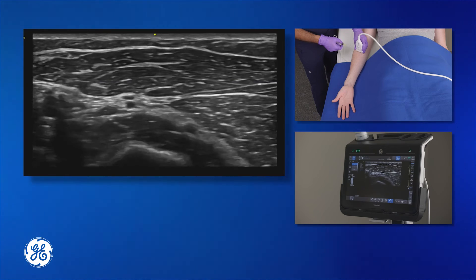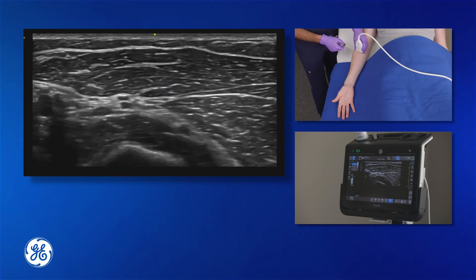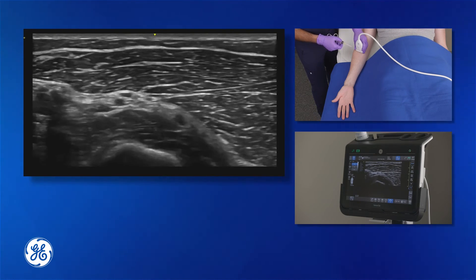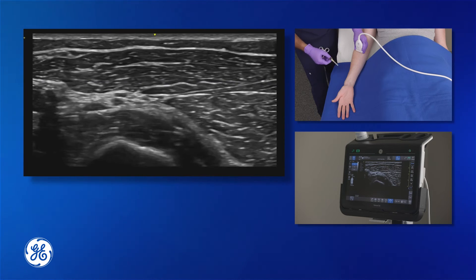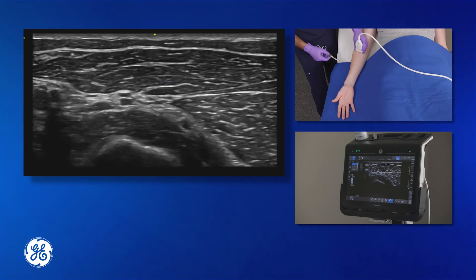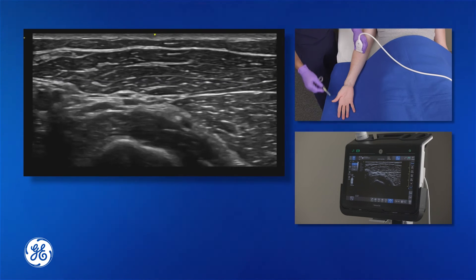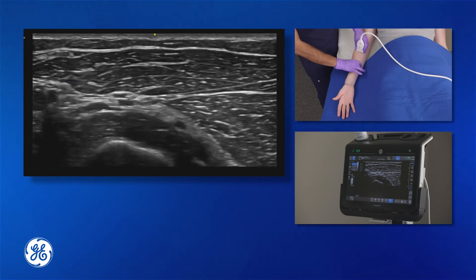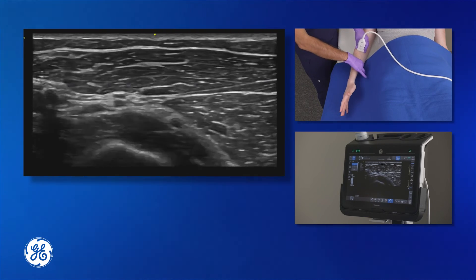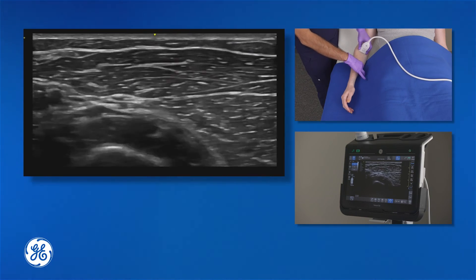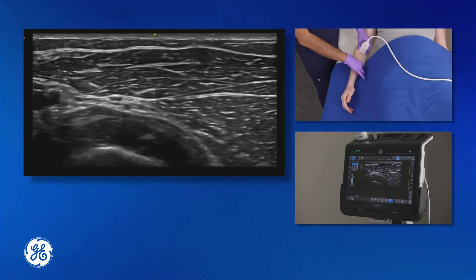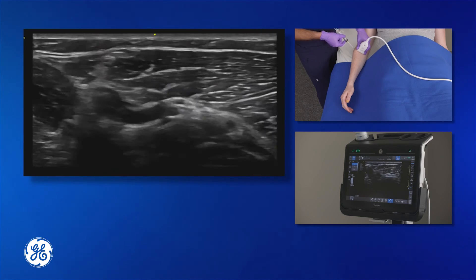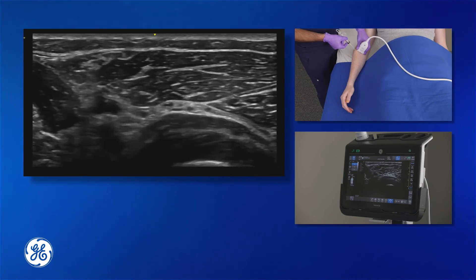The goal is to encircle the nerve in anesthetic, which allows for full anesthesia provided to the distribution of the radial nerve within the hand. Sometimes it is necessary to rotate the arm slightly, maintaining the view on the nerve, in order to bring the needle in at the proper angle.